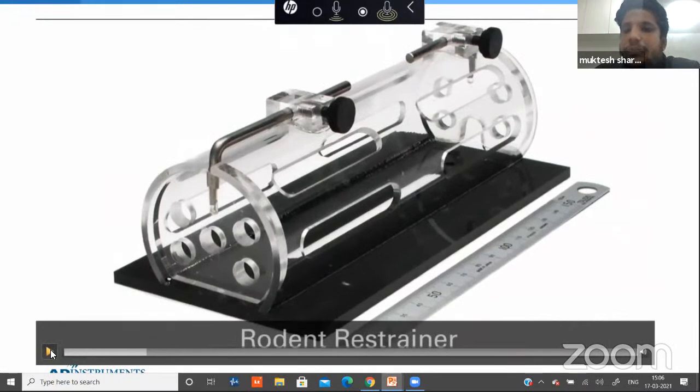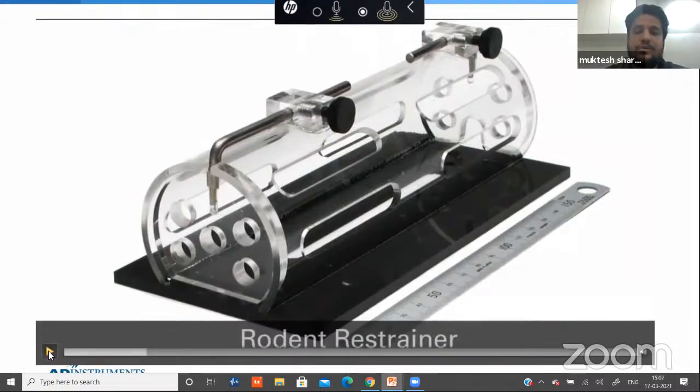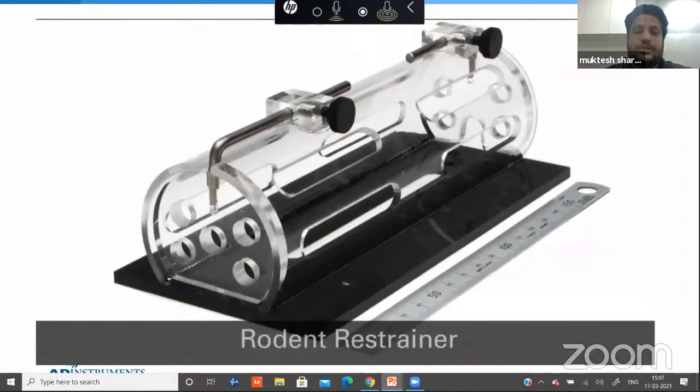So basically, they are telling you about the controller, the NIBP controller required, a PowerLab is required, and LabChart. And according to the different size of the animal, we use different restrainers. It is very mandatory to train your animal before you do the actual recording, so that they can be comfortable in the restrainer and the data becomes accurate, because we are not anesthetizing the animal in this. The animal is restrained in the chamber. So it is very important that the rodent should be very comfortable, so that the data we want to get from the rodent is accurate. So they will tell you how to train the animal as well as to record in the restrainer.